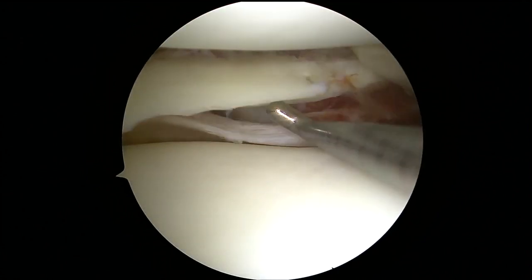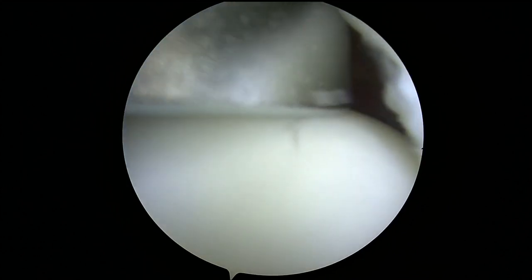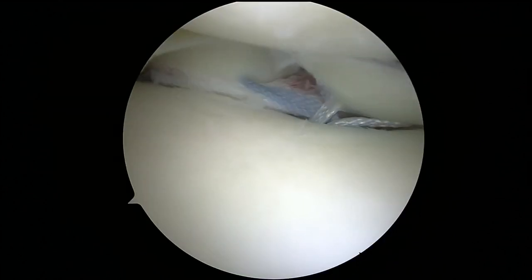The patient had a large radial tear at the posterior horn of the lateral meniscus. Two transtibial tunnels are drilled and sutures are passed through the edges of the radial tear. These sutures are then pulled down the tunnels to approximate the edges of the tear.